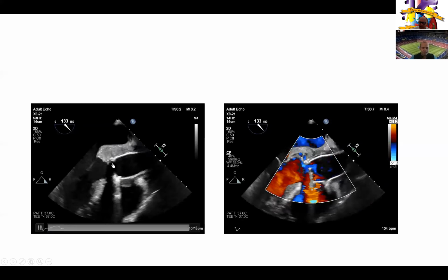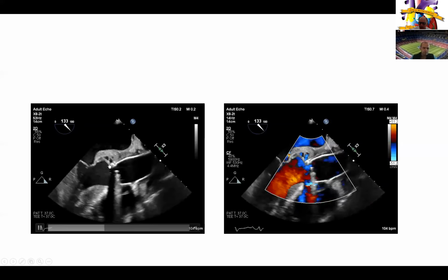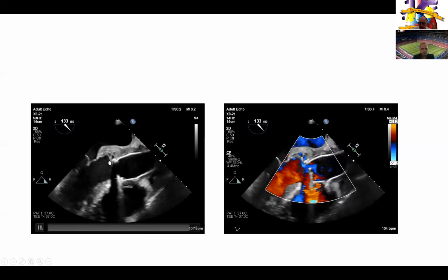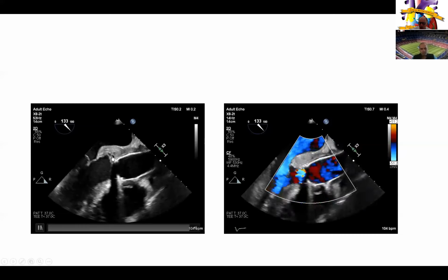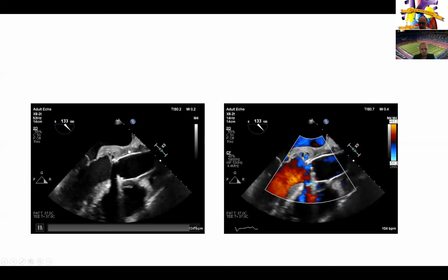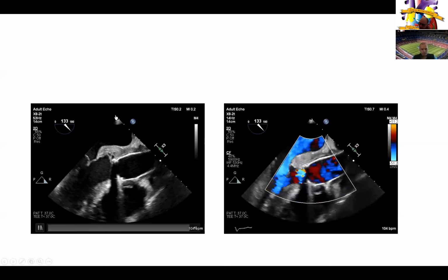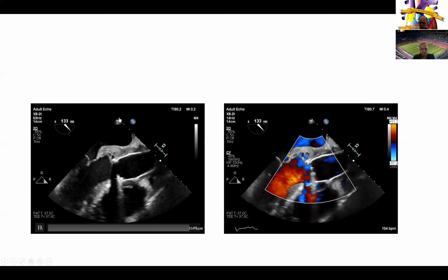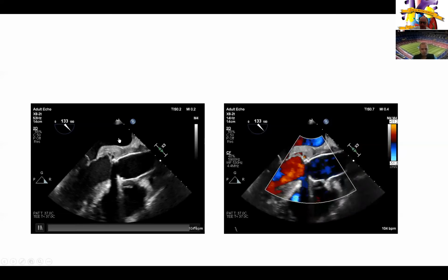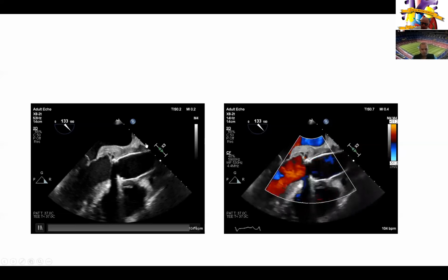Yeah, you can see that disconnect between where the aortic valve suture line is right here and the mitral valve, and that's where the abscess basically takes hold, right at, as you said, the aortomitral curtain, and tracks all the way up posteriorly. So for those of you who don't do TEE, this is posterior because the probe right now is in the esophagus, looking at the valve from behind. So this is all posterior, tracking all the way up.